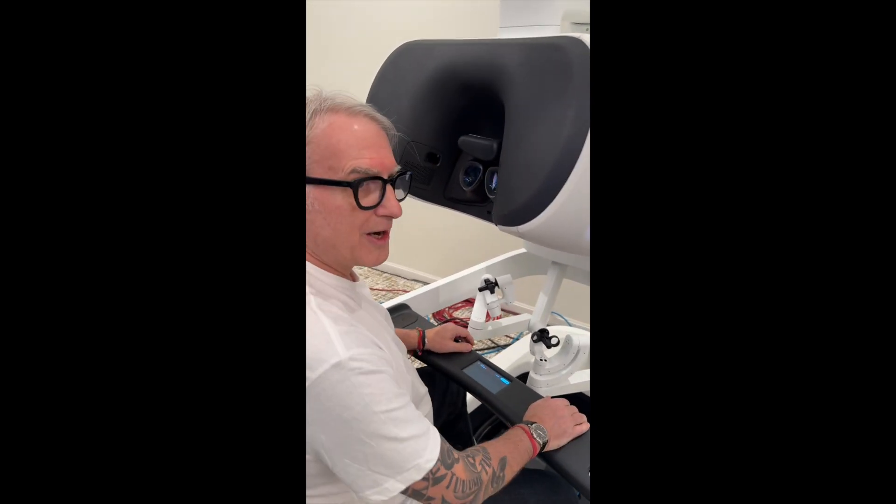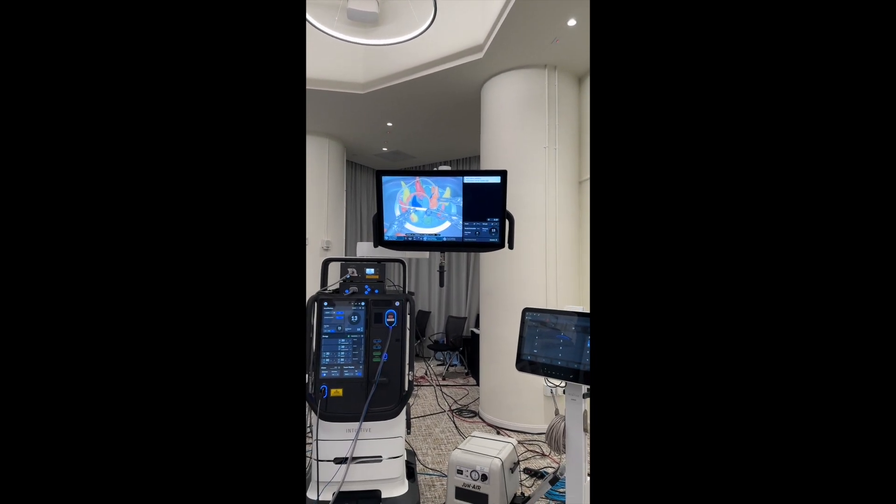The first thing I want to show you is how this haptic feedback works. I'm going to grab a piece of rubber — you'll be able to see that on the video. There are two things: one is the ability to feel the sensation of the strength — how the tissue gets grasped, the force. So if I grab a piece of bowel, I'm not squeezing it too hard; you can regulate the amount of the squeeze. I'm also going to be pulling on a rubber band — it'll tell me how hard I'm pulling. And second, I'll be pushing on different areas and be able to tell if I'm pushing on something hard or soft. With what I do — endometriosis surgery — I'll be able to tell if I'm pressing on something hard like fibrosis, or something soft like healthy tissue.